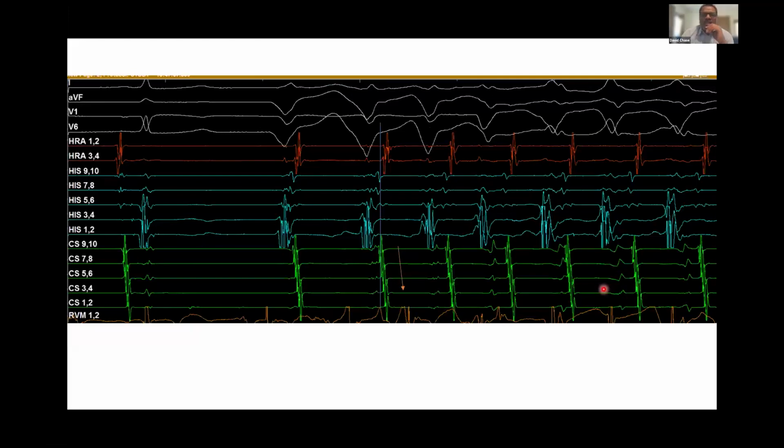So I talked about atrial pre-excitation. Without going to the nuances, the actual arrhythmia or tachycardia or accessory pathway, which was evident for the previous slide, I would like here now to point to another aspect without going to actually what's going on there. So I talked about atrial pre-excitation causing ventricular pre-excitation. Now I want to point to the same patient's ECG, which shows a relatively narrow QRS.